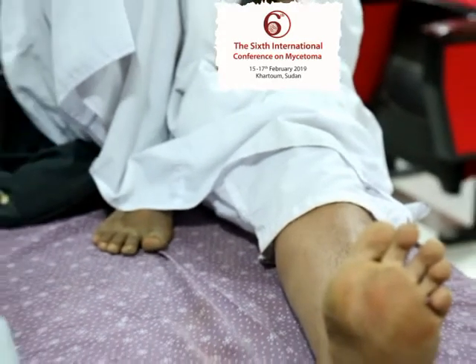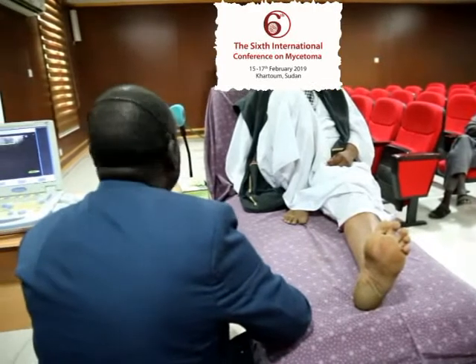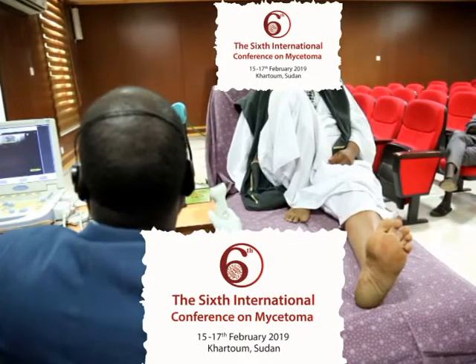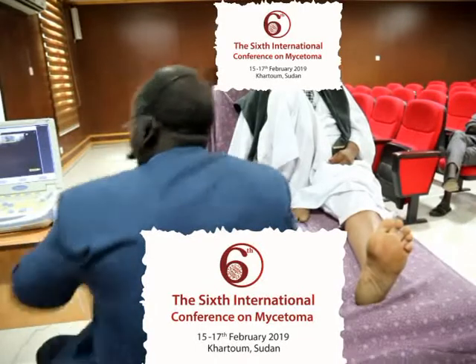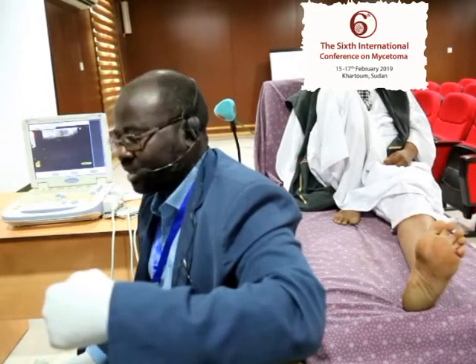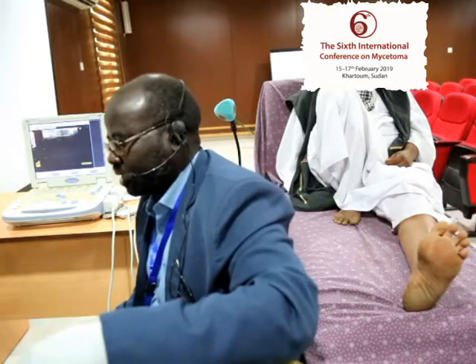Okay, thank you for the question. By ultrasound, it's easy to differentiate between the two types, concerning the grain size and echogenicity. First of all, the echogenicity tells us whether this is eumycetoma or actinomycetoma, because a grain of eumycetoma, as we have seen here in this case, is sharply echogenic. You can pick it up very easily.